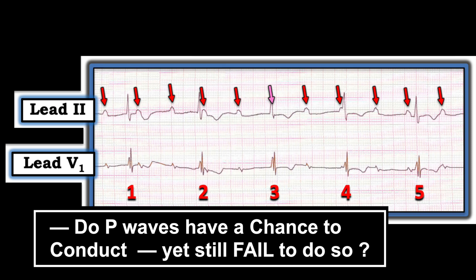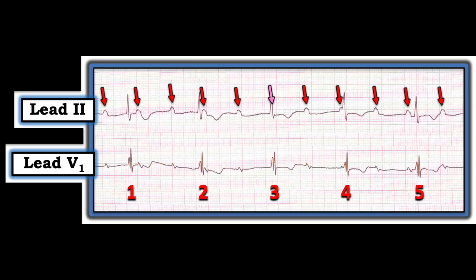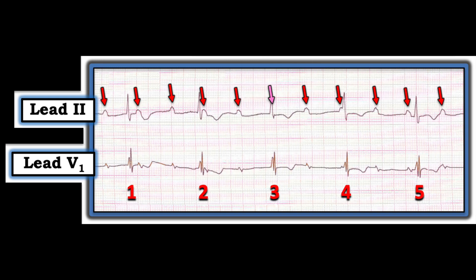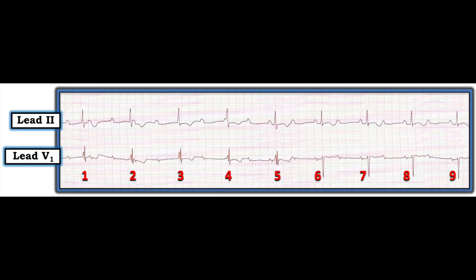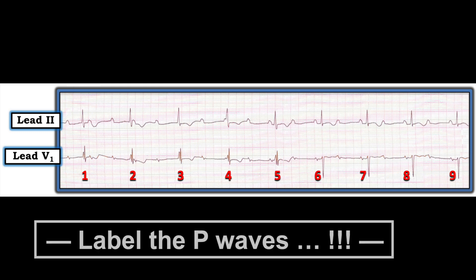If you look at all of these P waves, most of them occur either in the middle of the R-to-R interval or close to the QRS complex, but I don't have P waves occurring at all phases. This P wave right in front of beat number four — there's no way that can conduct; it's way too short to conduct. Let me prove this with the last part of this tracing. Here are the last couple of beats — take a moment to look at this rhythm strip.